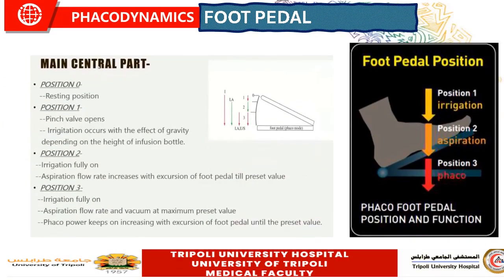Now we come to the foot pedal. As you can see, all the functions of the Phaco emulsification are controlled intraoperatively by the surgeon through the foot pedal. So the foot pedal is a very important structure joined to the Phaco emulsification machine, because all the functions of the Phaco are controlled by the surgeon through it. You should understand carefully the utilities and the functions of the foot pedal.